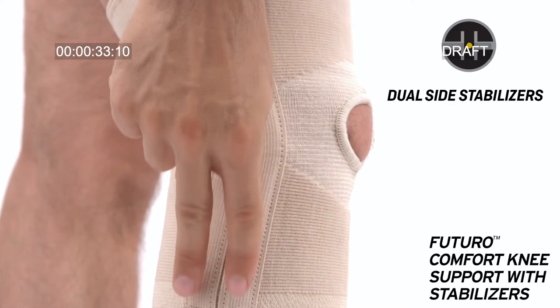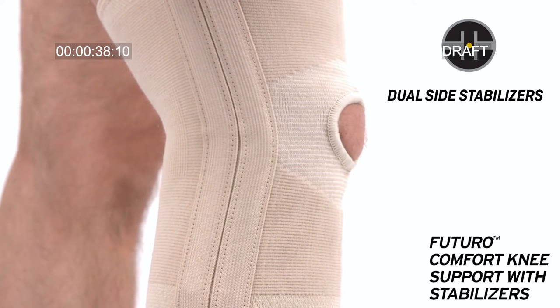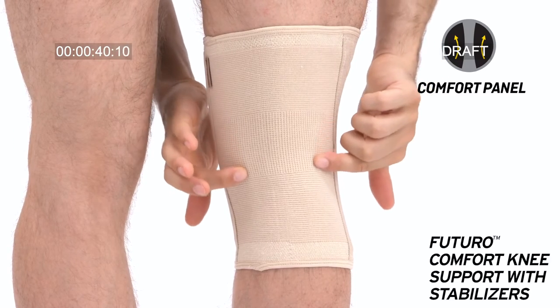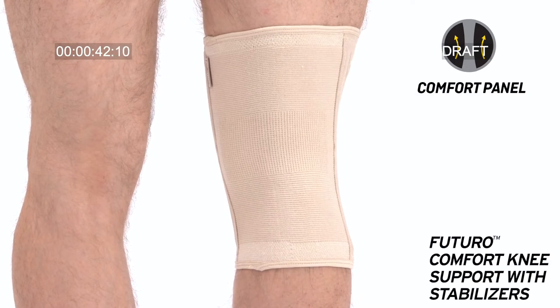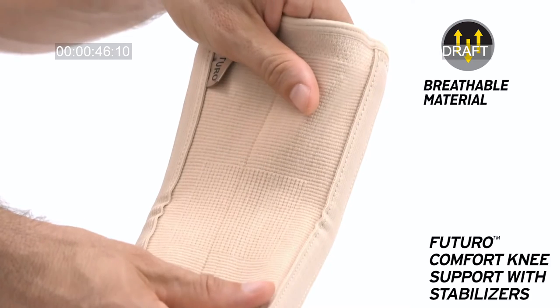Dual side stabilizers provide extra stability without limiting movement. Comfort panel behind knee to reduce bunching, contour design for optimal fit, and breathable material.